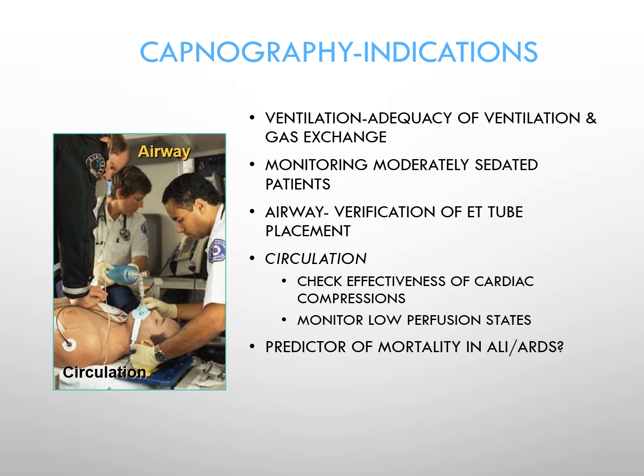Another traditional indication is what I alluded to earlier, and that is monitoring or verifying the placement of an advanced airway such as an endotracheal tube.